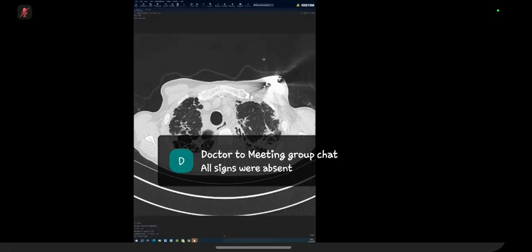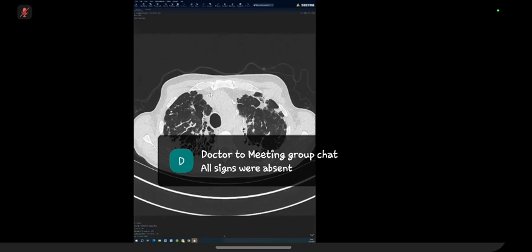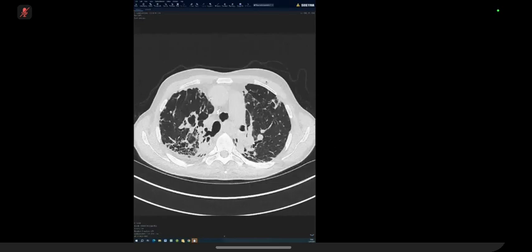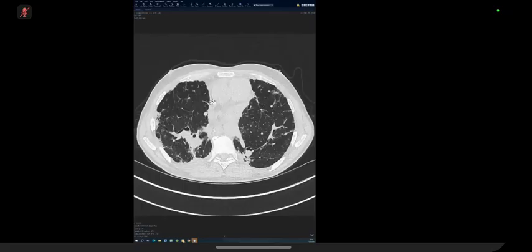And if you see that, the expectation would be to think down the sarcoidosis route pretty quickly. And then the next question will be, what stage of sarcoidosis is this? And then, do you know the stages of sarcoidosis? Can you tell me the stages, etc., which I'm sure you do. So that's that one done.